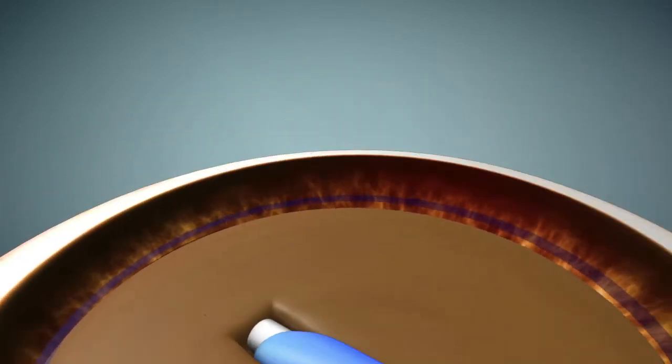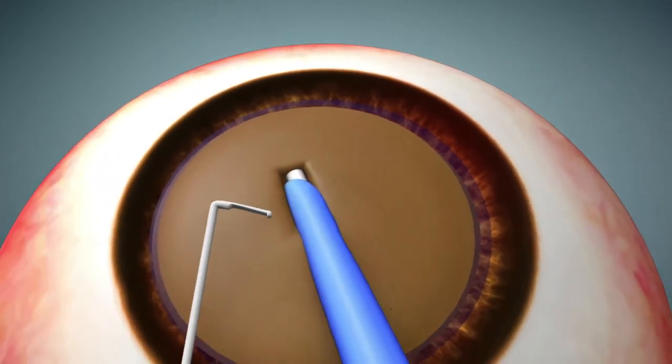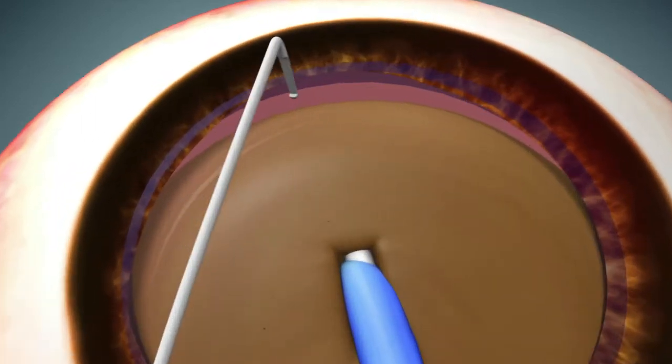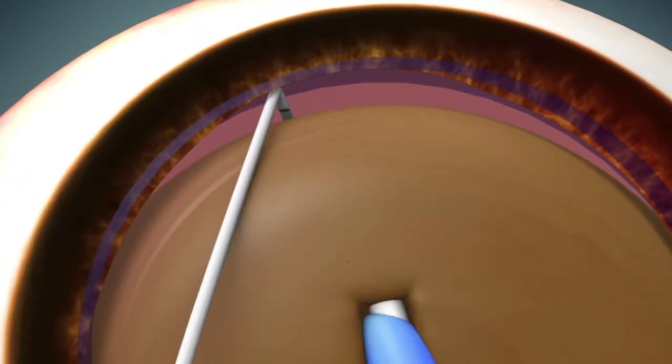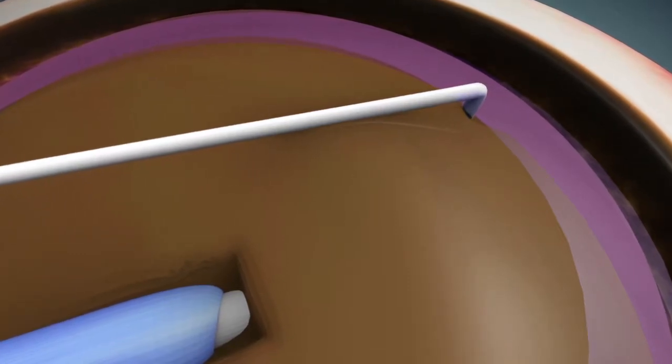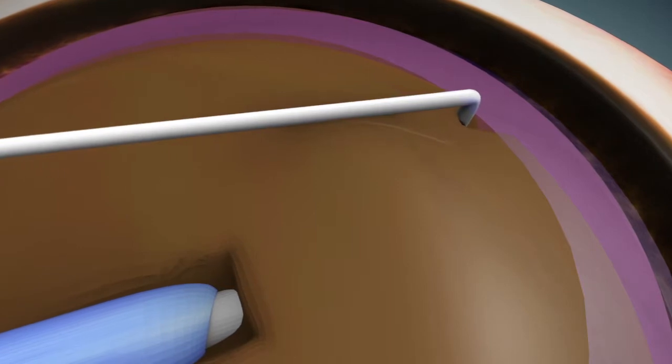The thin and soft equator of the nucleus is then hooked with a blunt chopper after drawing and lifting the nucleus edge within the capsulotome margin. The chopper is then drawn into the thin and soft nucleus to create a small full-thickness nick adjacent to the phaco tip.